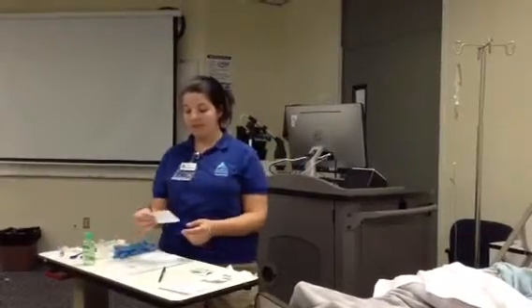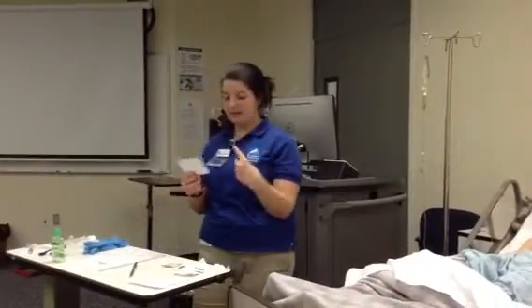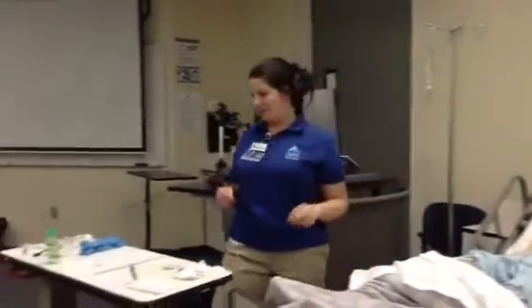Okay, but before I would even give Zosyn, you said you had Zosyn before? Yes, okay, good. So you know about it. It's an anti-infective. I also look at my drug book for the action, the side effect, the nursing implication, and the infusion time, which is 30 minutes. Okay, and I'm going to look at that site that you already have your primary in, and everything looks good. No signs of phlebitis or infiltration.